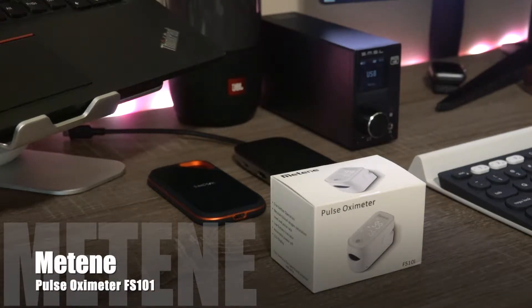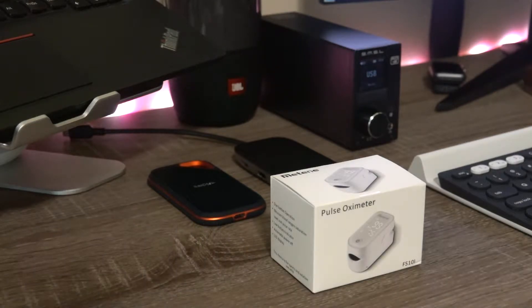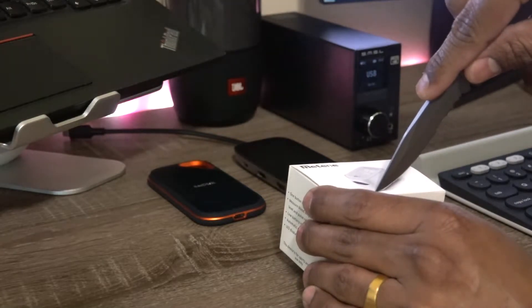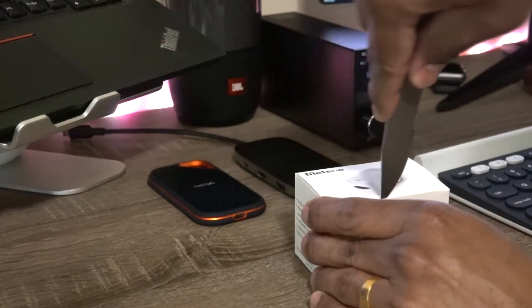Hey guys, how you doing? So I'm here to unbox the pulse oximeter which I had purchased from Amazon. The brand is called METENE and it's white in color, so let's go ahead and unbox it.